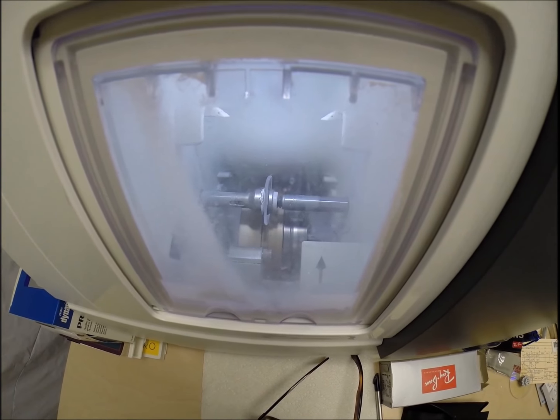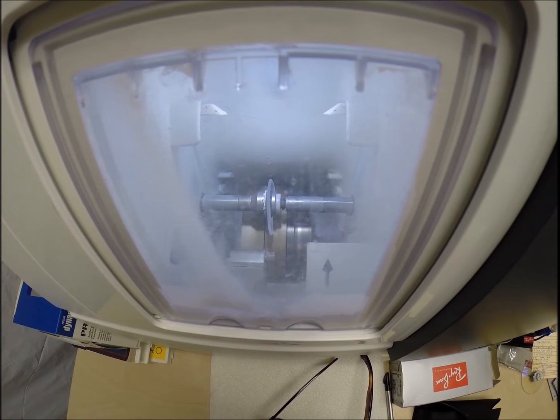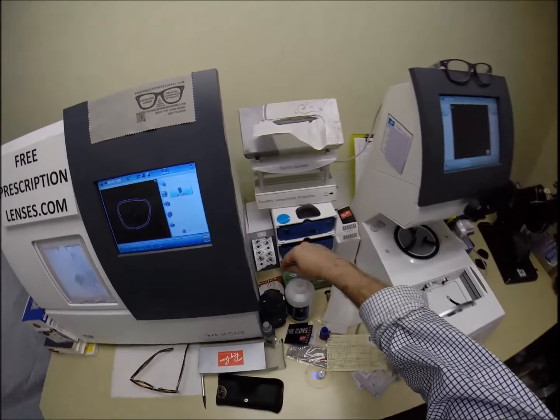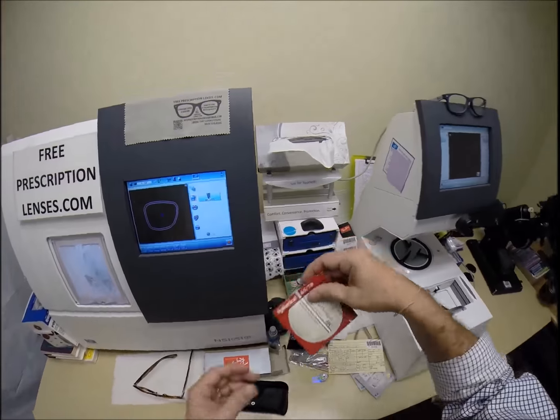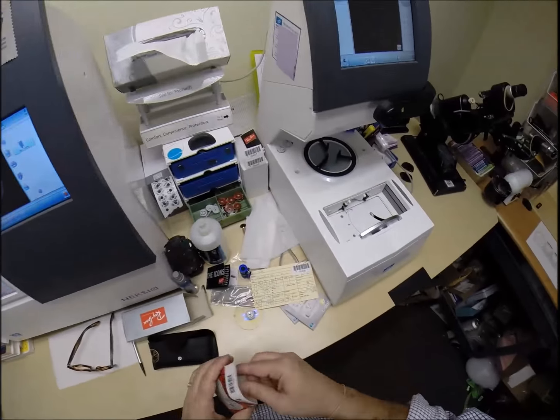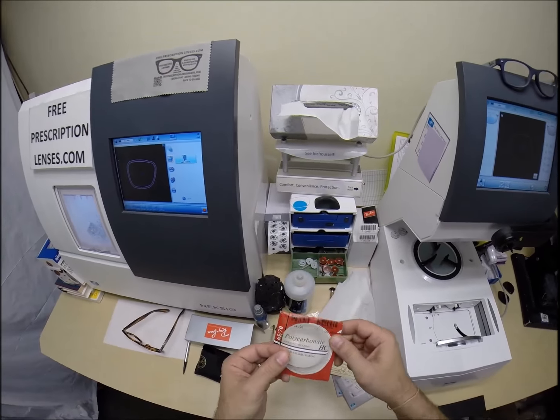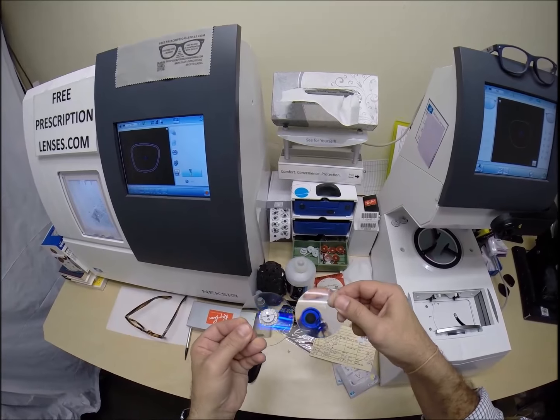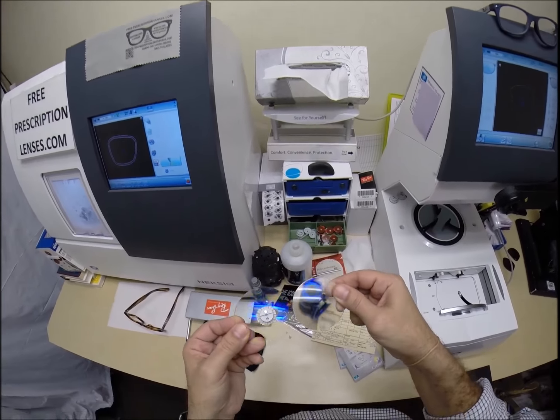Now, anti-glare is 3 features in one. It reduces glare when driving at night, particularly driving at night in the rain, but from street lights, stoplights, computer screens, overhead fluorescent lights and such. It also goes by the initials ARC, which stands for anti-reflective coating. So it reduces reflection. So when someone's looking at you, they're not looking at their reflection in your glasses. So it makes for much better eye contact.